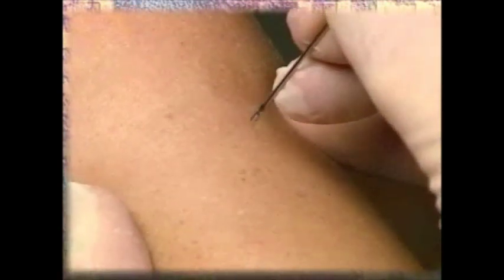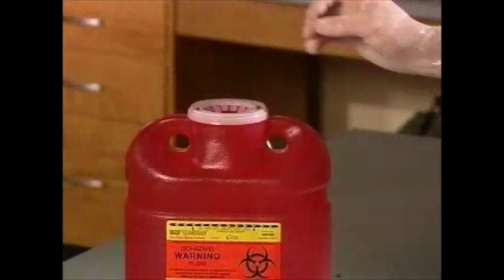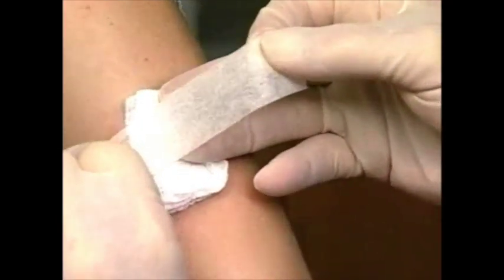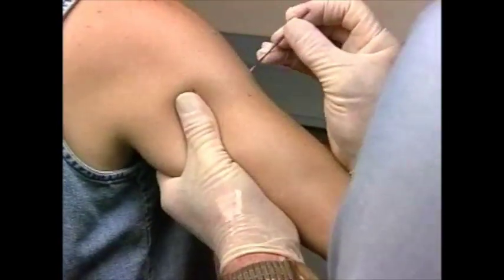Administering the strokes rapidly within about 3 seconds also helps induce enough pressure by the needle to produce this small amount of bleeding and assure that the vaccine was administered appropriately. This method allows the live vaccinia virus to penetrate the superficial layers of the skin so that viral multiplication can occur and produce immunity. Once the vaccine is administered, you should dispose of the needle into an appropriate sharps disposal container. Cover the vaccination site with a piece of gauze or other appropriate dressing. Here is the vaccination procedure again.